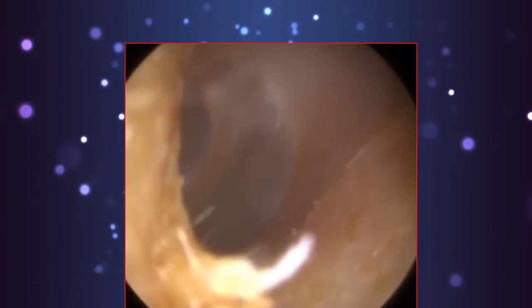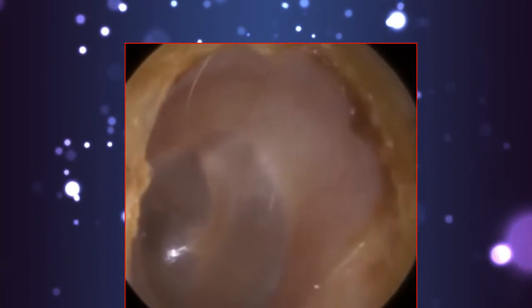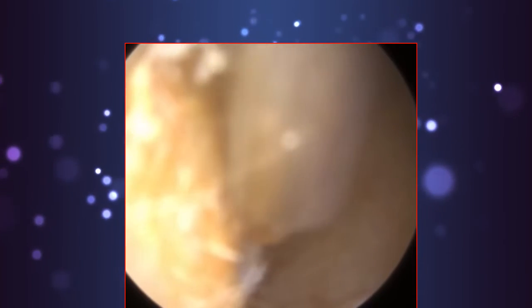You just see how dark that is, so that's been there for a while, it's oxidized. So again, more medially, the ear canal is really healthy. So there's a lovely view of the eardrum, which is nice and healthy. The canal wall, medially, on the bony part, looks pretty good. It's just more laterally here. You can see all this dead skin, and it's really, really frustrating for the patient's itchiness. It's something that they suffer from chronically. It can really get them down.